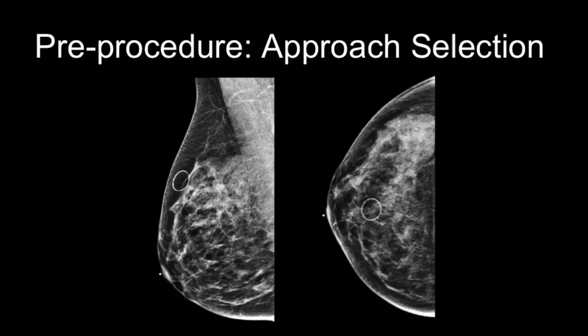Let us practice this concept with another example. Here we have a 90-degree lateral and CC view of the right breast demonstrating an oval titanium marker within the slightly upper outer right breast. On the lateral view, the target is closest to the superior skin surface; on the CC view, closest to the lateral skin surface. The lateral distance is clearly the shorter of the two, so we would use a lateral approach in this case.